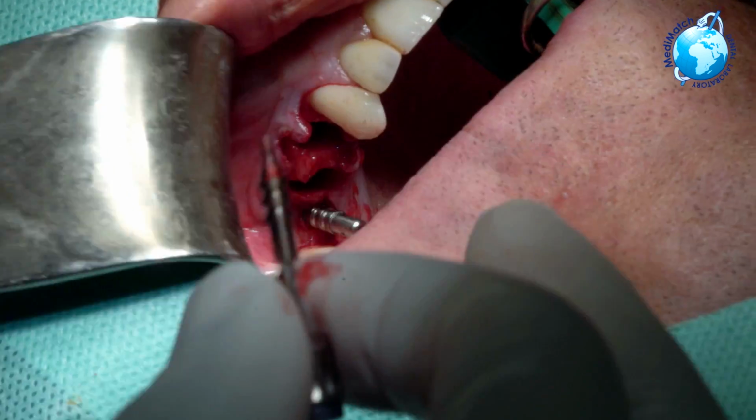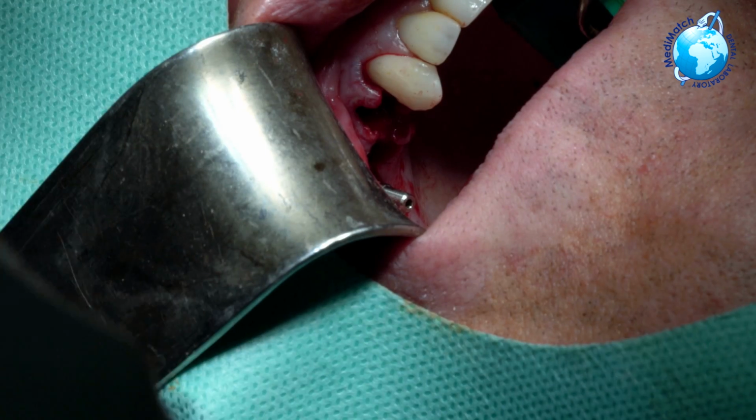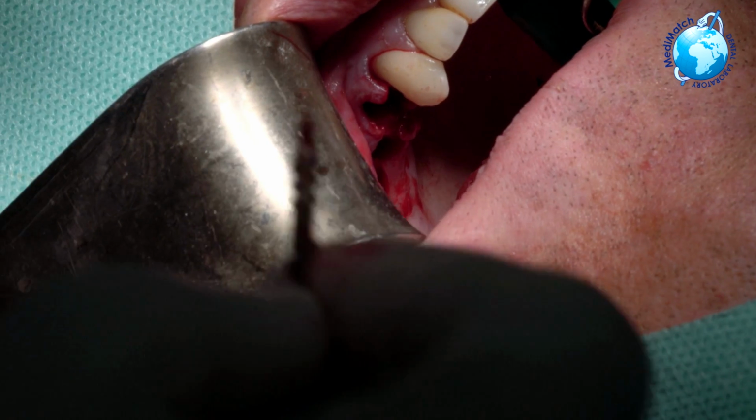So what we're doing is just going to put some synthetic grafting, no membrane, over the whole area to support the tissues. I also get an improvement of the biotype of gingiva. So when we get non-attached gingiva, actually the gingiva gets thicker. As well as developing actual bone with this material, it's resorbed completely by the body, it's synthetic, and there's no pigs in it, or cows.